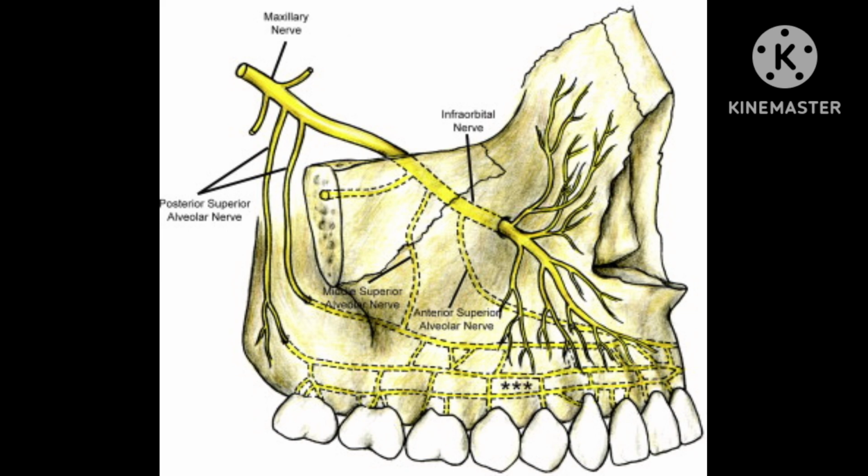Premolars: infiltration is done buccally, apically, usually 1.0 to 1.8 milliliters of solution. Molars: in the molar region, the zygomatic bone, zygomaticus, may interfere. Therefore, the lip and taut mucosa are pulled outward and downward to create space.